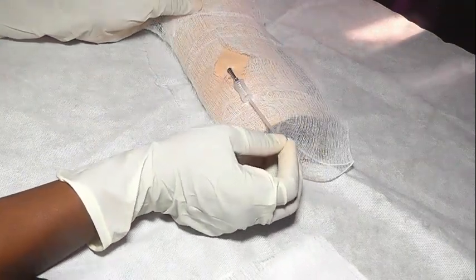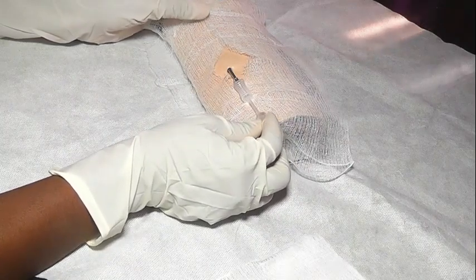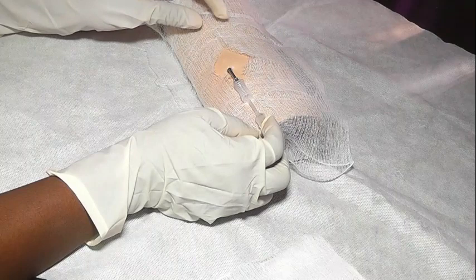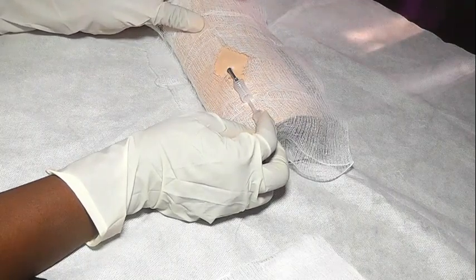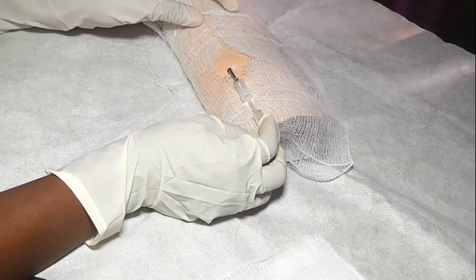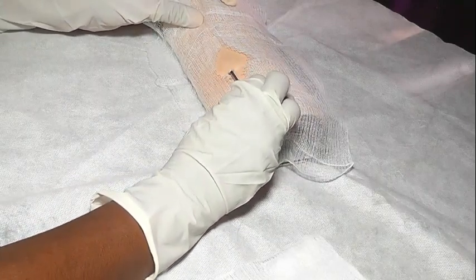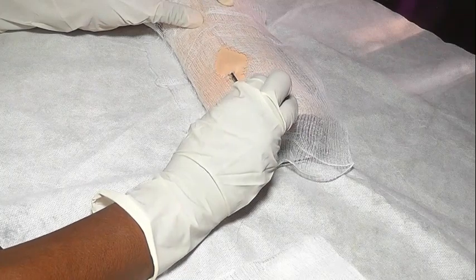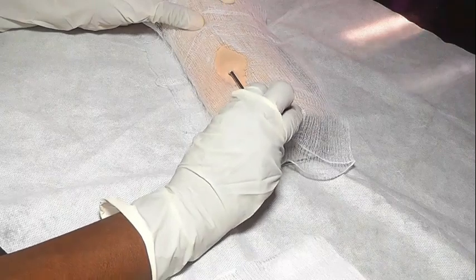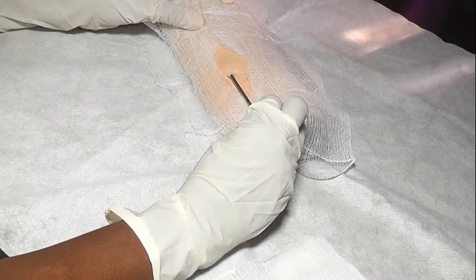Now in pushing the plunger, the rod, you push gently and you make sure that when you feel a resistance, you don't continue pushing. Okay, so I'm feeling a resistance, so you can see there's a resistance, so I will not continue pushing. Then I will withdraw the trocar until the mark that is very close to the tip is seen.